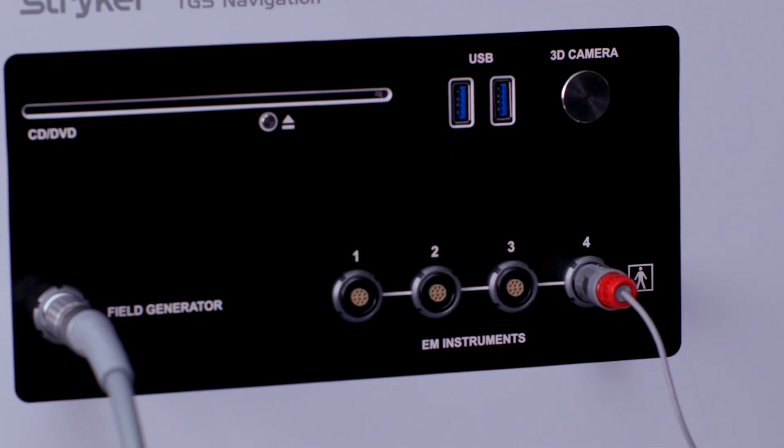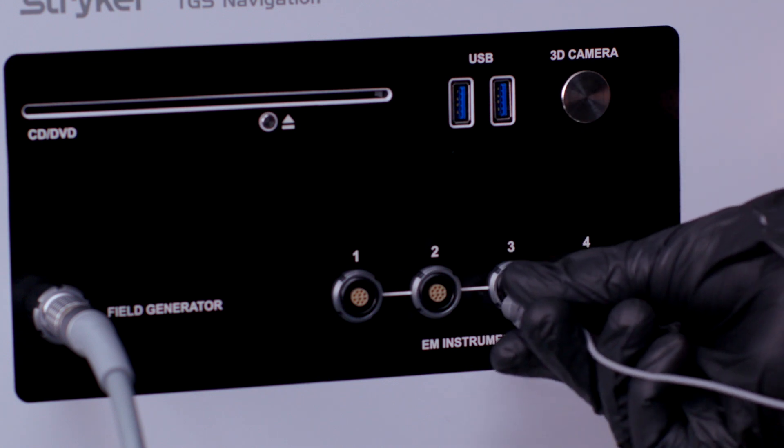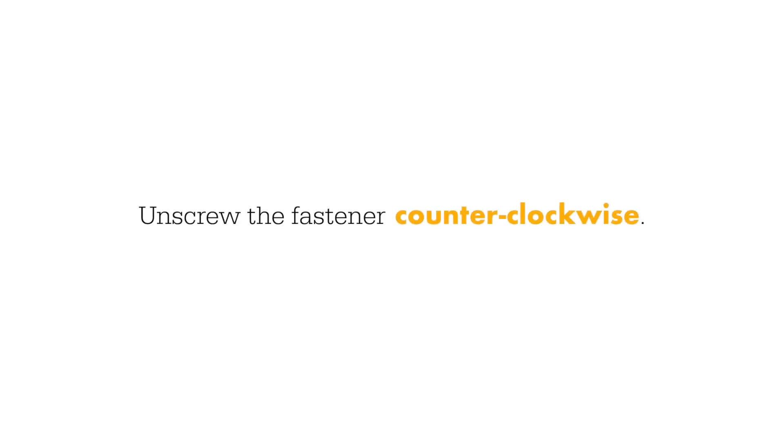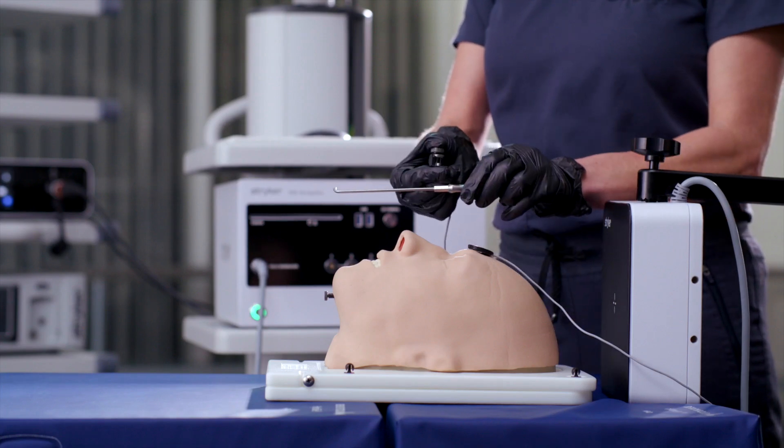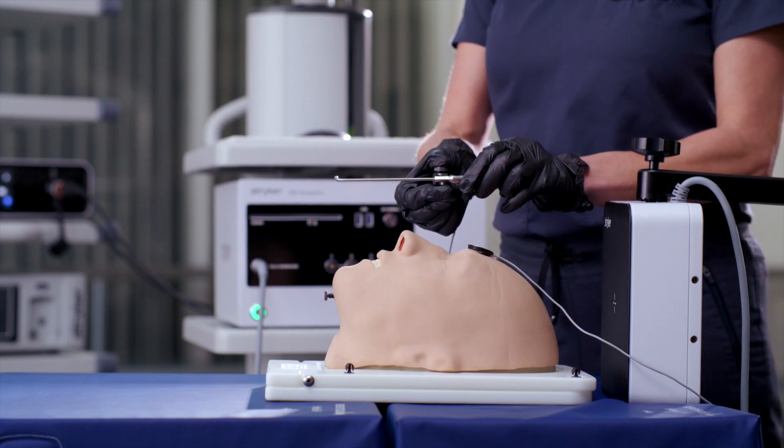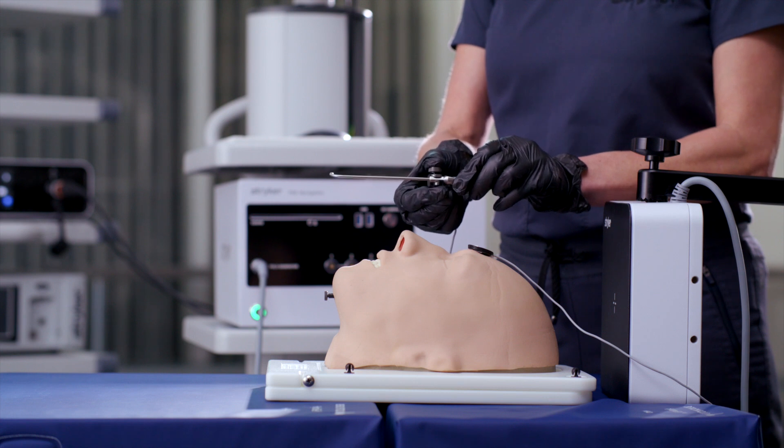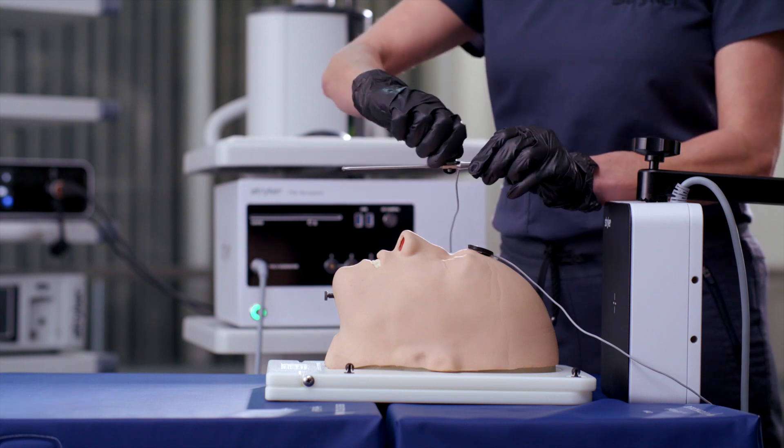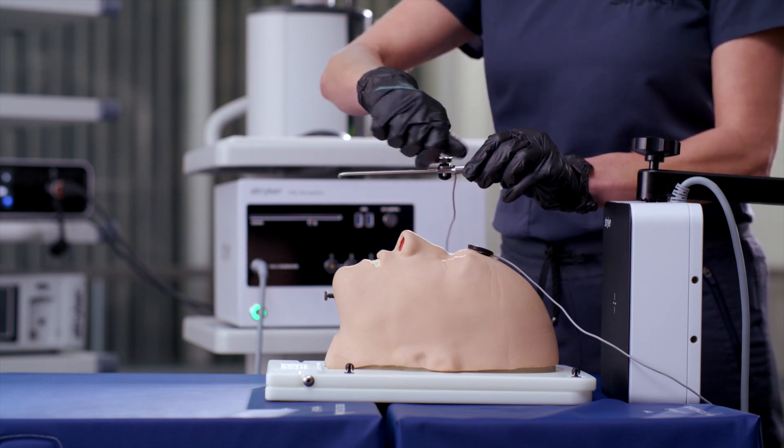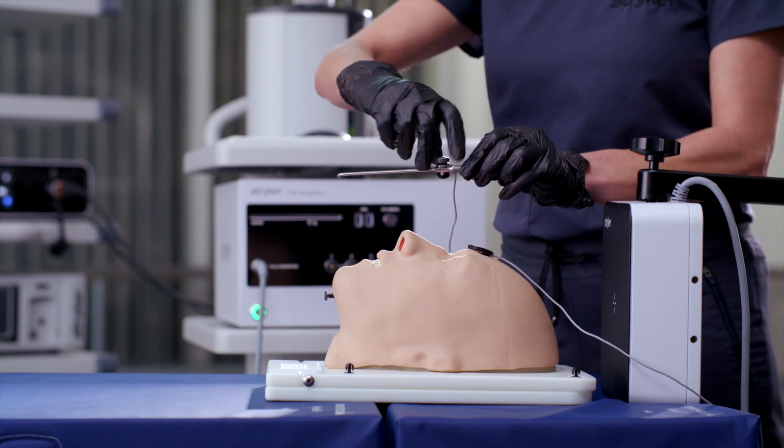To connect the universal or sphere clamp to a rigid instrument, unscrew the fastener counterclockwise. Press and hold to allow for the surgical tool to be slid through the opening with the wire facing toward the user. Tighten the fastener clockwise until the clamp is securely connected to the navigated instrument.